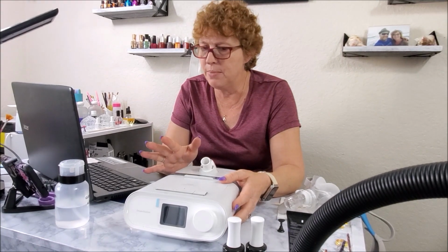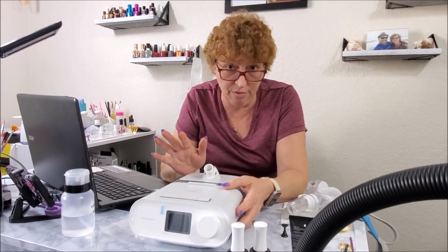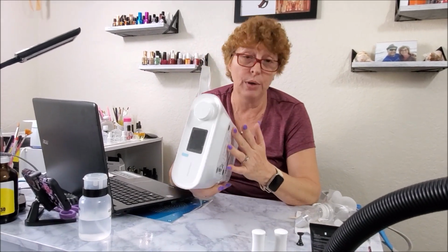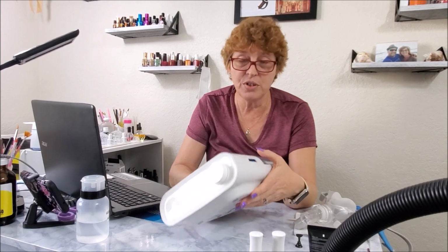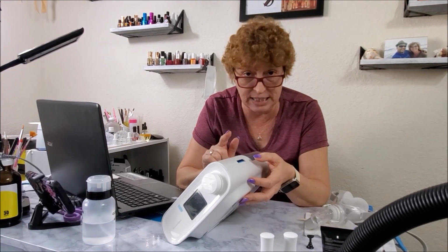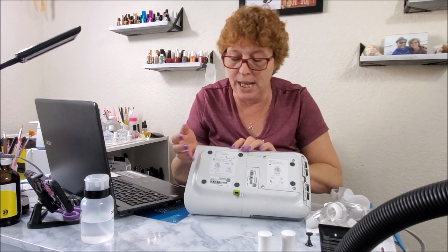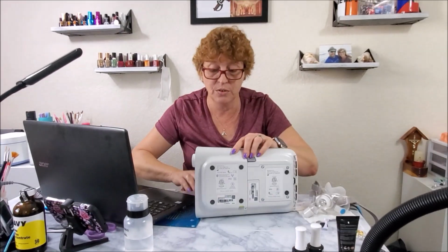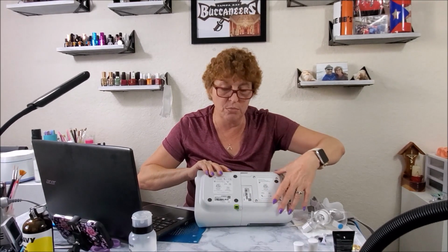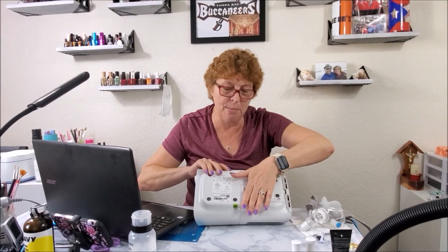Okay, so I'm going to put in the website where you guys can go, for the ones of you that do have a CPAP, whether it's a bi-level CPAP like mine or a regular CPAP that's made by Philips. When you go to fill it out, it's going to ask you for the serial number on your CPAP. As soon as you put it in and hit submit, it's going to spit back whether your machine is affected or not affected. Mine is. So just remember your serial number: power button, serial number. This serial number here is for this part of the machine. So don't worry about this part where the water tank goes. You only worry about the front.